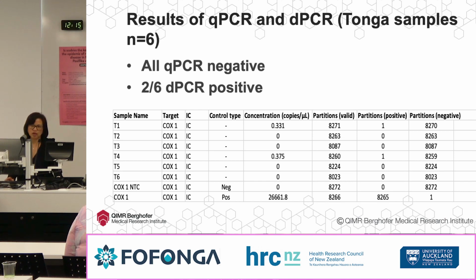Well, they went to Tonga way back in June when we had the second symposium there, and this is just when they're laying the groundwork. They sent me about six samples, just a handful, and this even got stuck in Australian customs for a bit. We couldn't clear it. But when I finally got it, of course, I immediately did the qPCR and they're all negative.